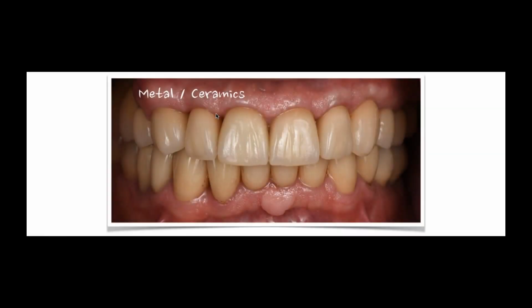Because in the end, we actually made this case in metal ceramic. Again, it was an upper and lower arch, and there weren't many different preparations done except for Bernadette's beautiful cleaning up of the preps and managing the tissue and the cord and all the normal things that she would do. But in the end, it was still a metal ceramic case. And I think you can see that there's a lot more depth, obviously a warmer color, more natural for the face of the person that we were trying to make.